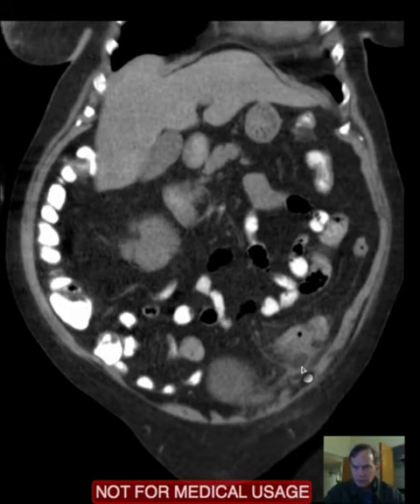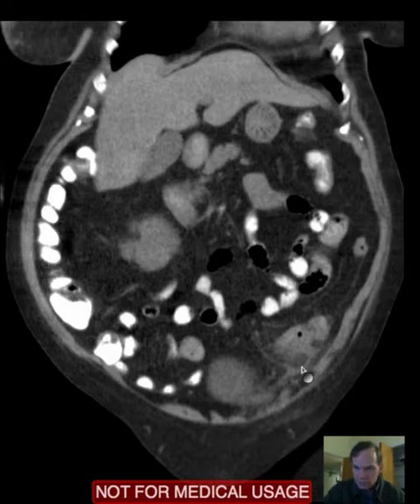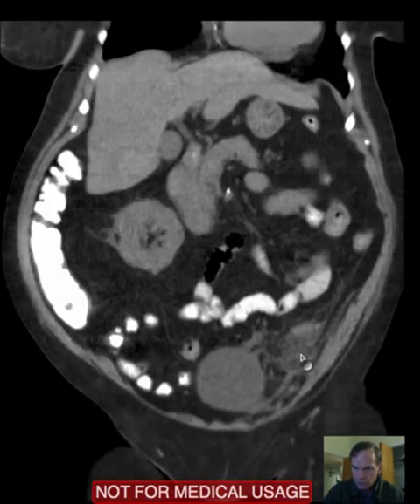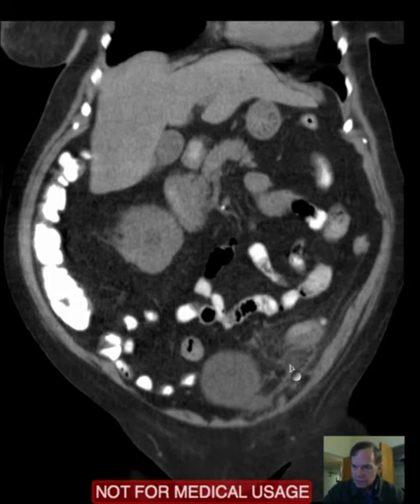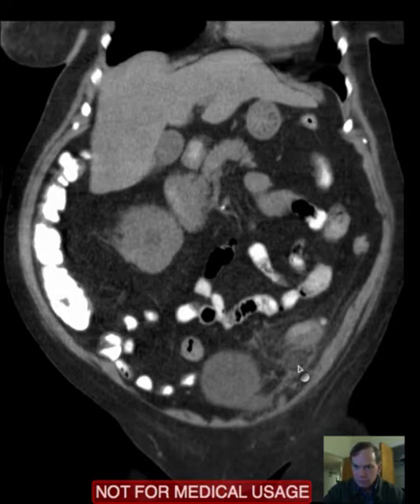It seems that it's arising from this area here, so this appears to be epiploic appendageitis. That is the appendix epiploica that hangs off the bowel has gotten inflamed, and what we have then is an inflamed epiploic appendage, which is called epiploic appendageitis.